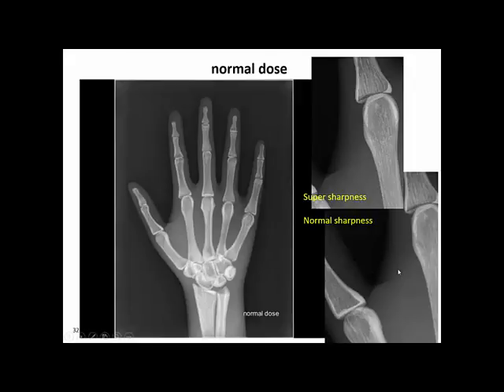If the customer would tell us they need much more sharpness, I simulated this and call it super sharpness. In this case, we see an increase of noise, of course, but also a very high increase of sharpness in the image. Whether this noise level is acceptable depends on the particular radiologist. We cannot answer that question, but here the responsibility of the customer steps in, and they have to tell us, is this enough dose for this kind of sharpness, or do we have to have less sharpness or more dose, or is this okay?